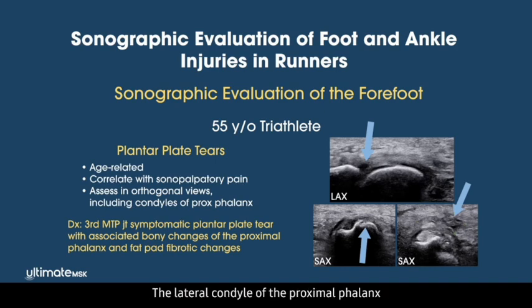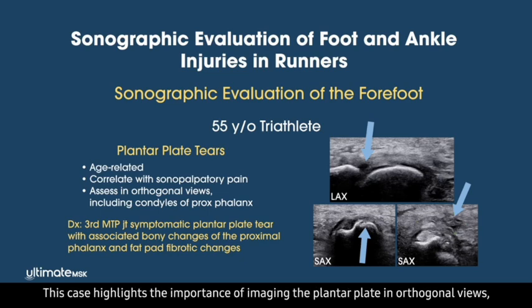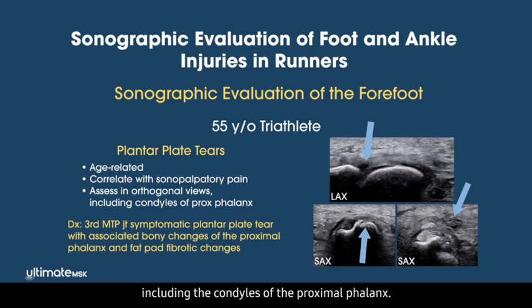The lateral condyle of the proximal phalanx and the thickened fat pad corresponded to the area of maximal pain with sonopalpation. This case highlights the importance of imaging the plantar plate in orthogonal views, including the condyles of the proximal phalanx.